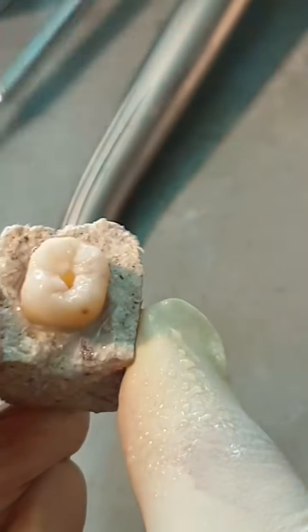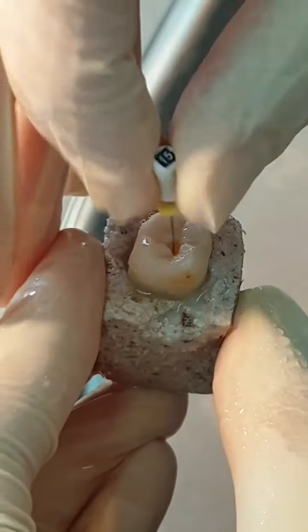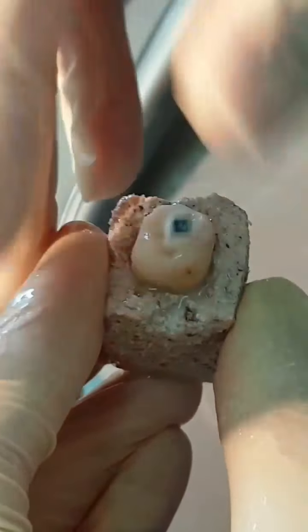Now again, we check with Explorer and number 15 K file. And as you see, we have access for distal canal now.